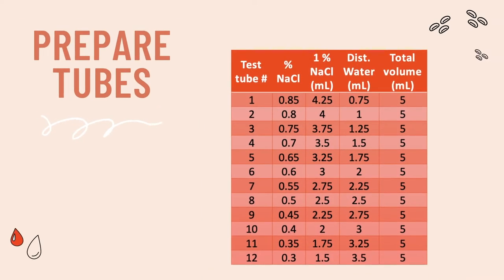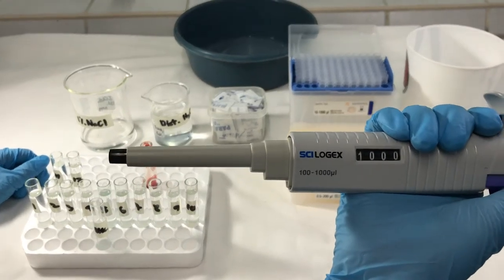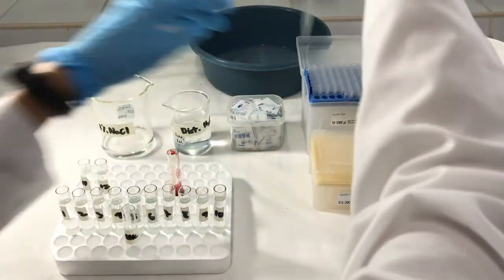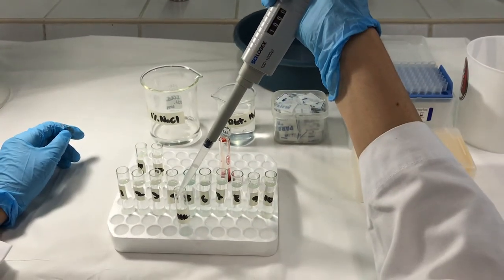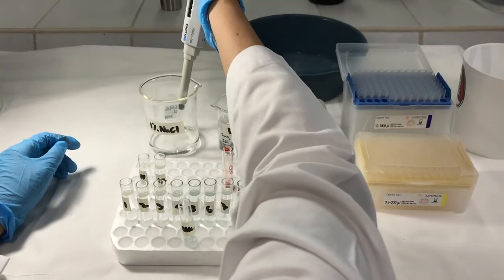Next, prepare your tubes using this guide. Our goal is to have a decreasing concentration of sodium chloride from tubes 1 to 12. Here we are demonstrating the preparation of a 0.85% concentration of sodium chloride. This should be the concentration in your tube number 1, as well as your blank.